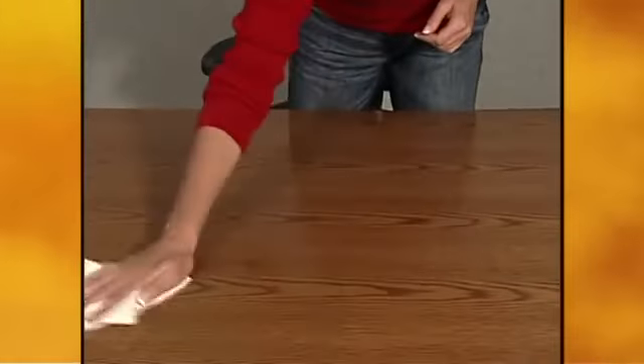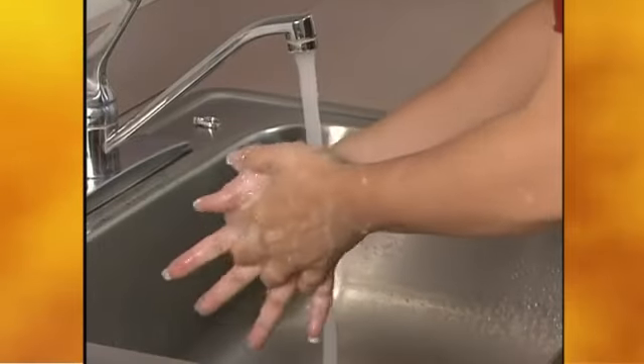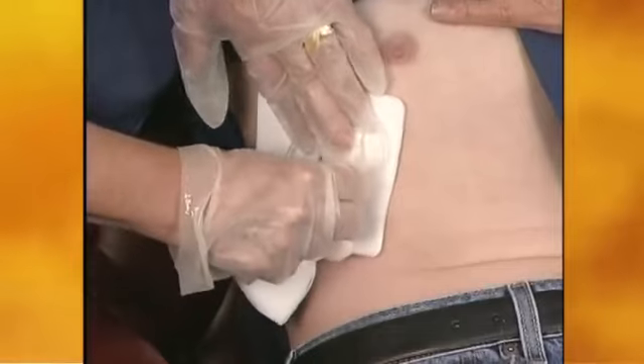A clean, clear area on a table or counter should be available. Instruct patients to remove rings and wash their hands thoroughly with soap and water, even though they will be wearing gloves. The dressing around the catheter should be removed and discarded.